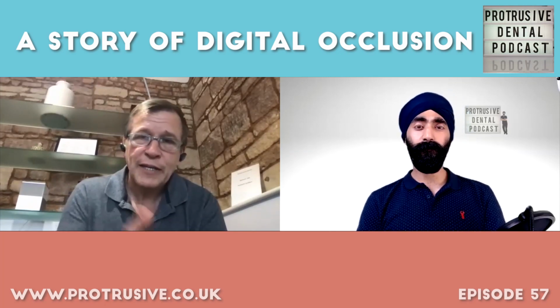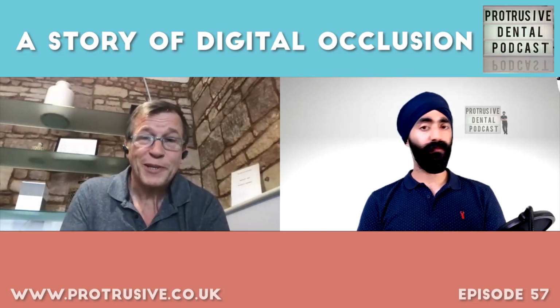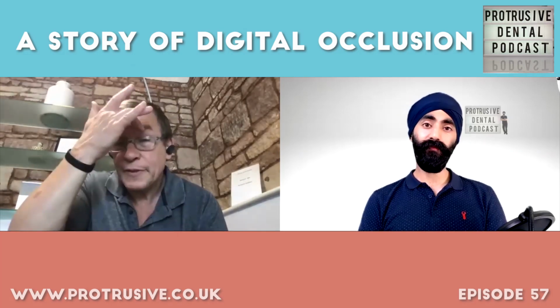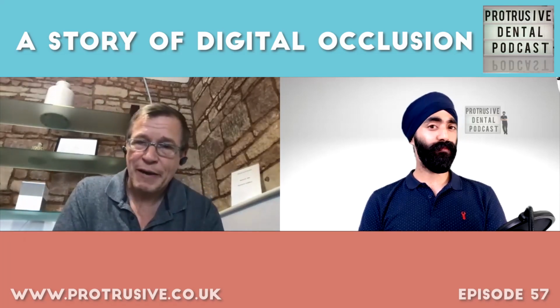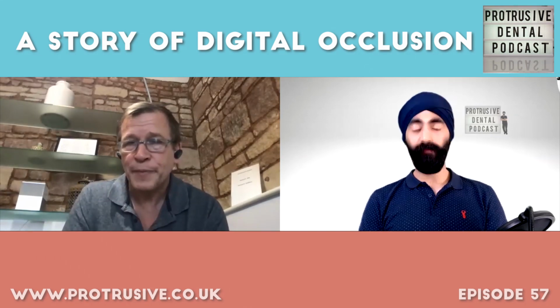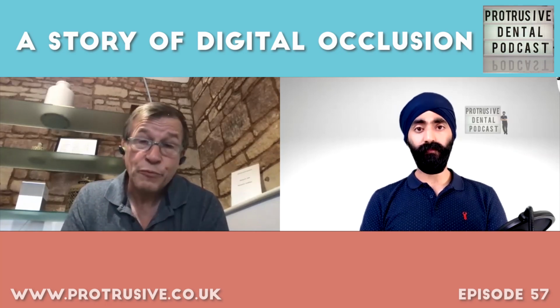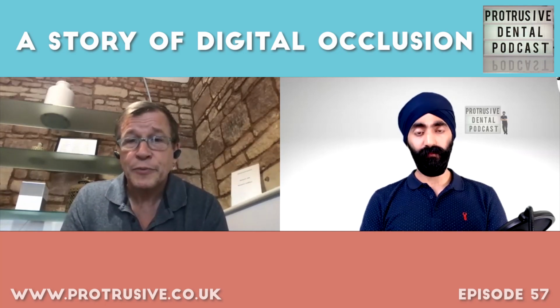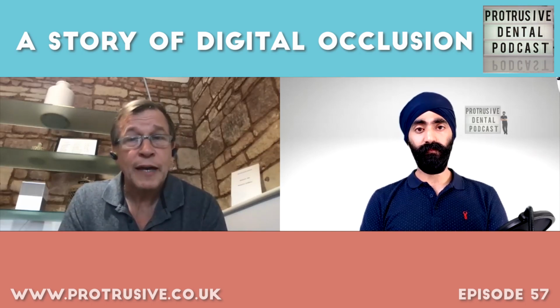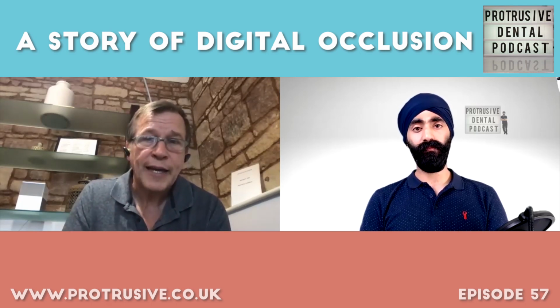One of the things that relates to that correct vertical, the correct vertical only works with a stable condylar position. So let's be clear about that. If we think about what we've just said about facebows and how we relate the teeth to that, how do we do it? We can choose a photograph that will be reasonable. There's certain things we put to 2D to 3D. We can use a face scan, which will give us more information still. We can use a CBCT scan if we have one.